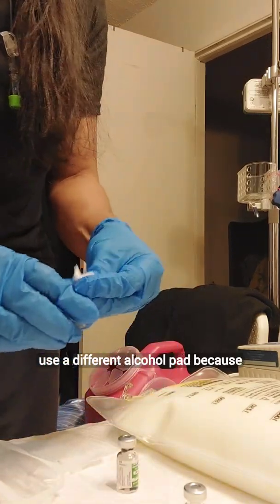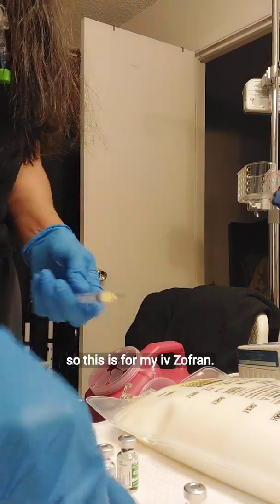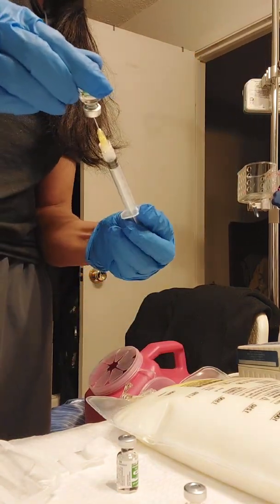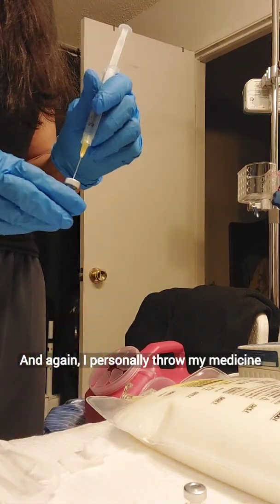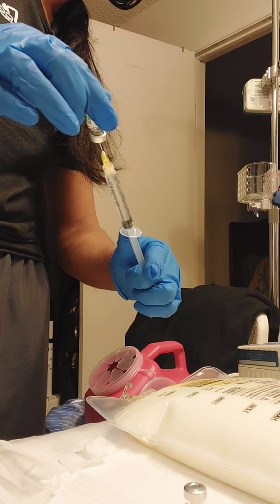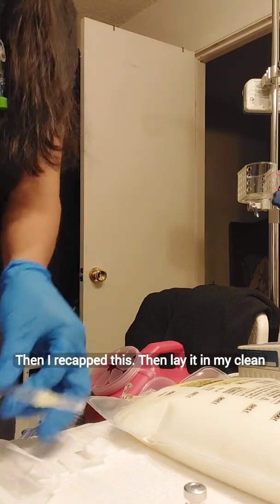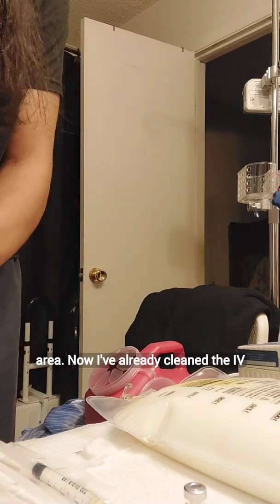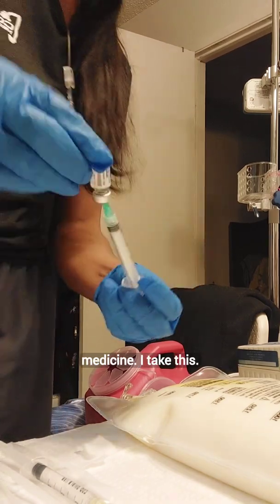I did use a different alcohol pad because they're different types of medicine. So this is for my IV Zofran. I personally throw my medicine vials in my sharps container. Then I recap this and lay it in my clean area. Now I've already cleaned the IV Benadryl, so it's my second syringe of medicine.